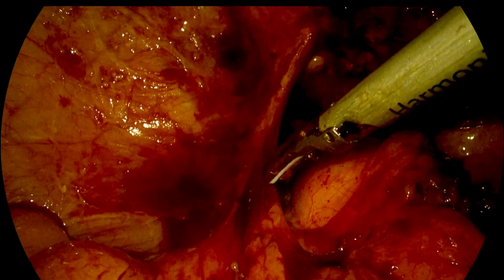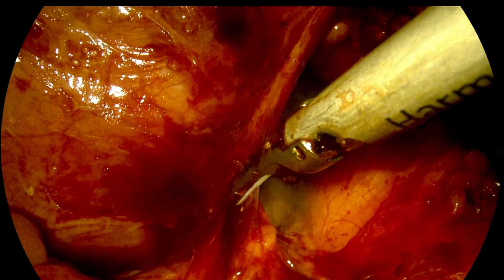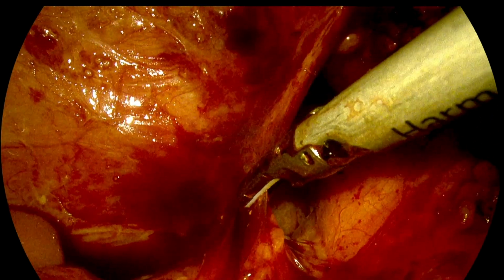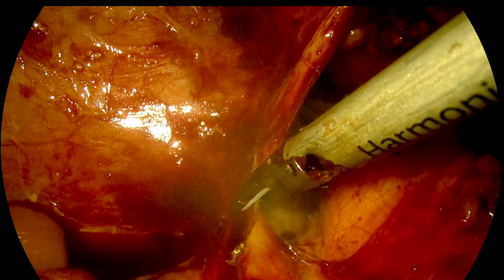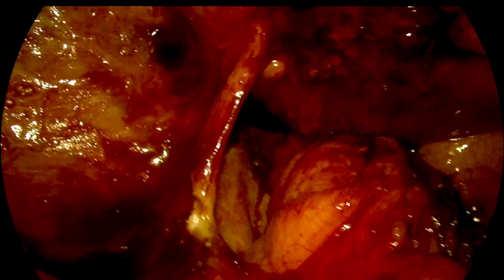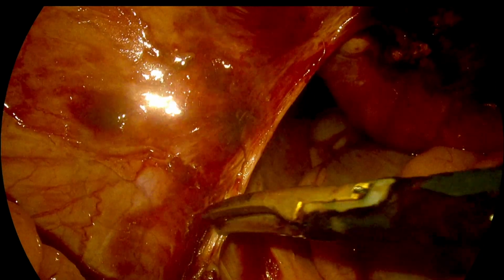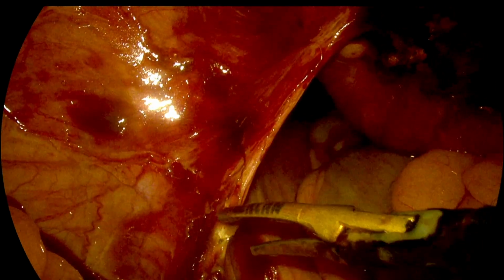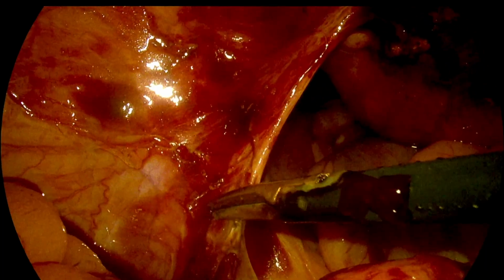Now you can see that though a salpingo-oophorectomy was already done, this is the adhesion band that is present between the lateral wall of the pelvis and the left side of the uterus. In these cases, some amount of fibrosis is seen even in the retroperitoneal area.